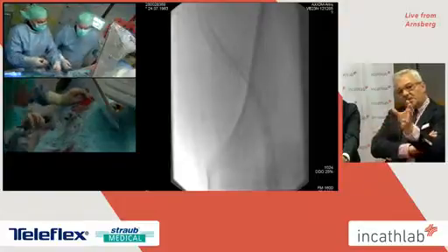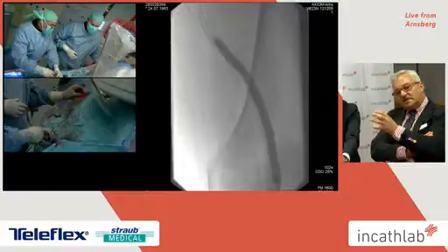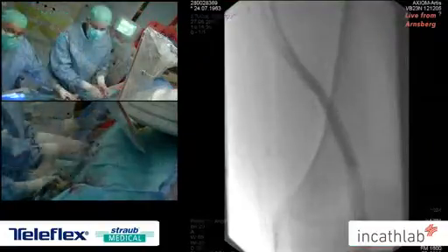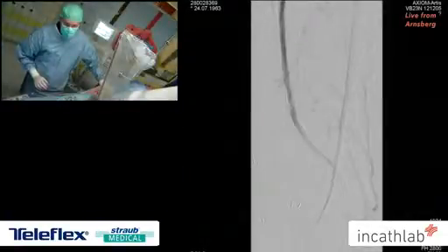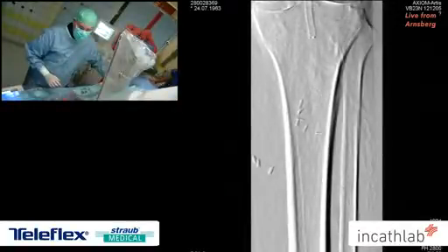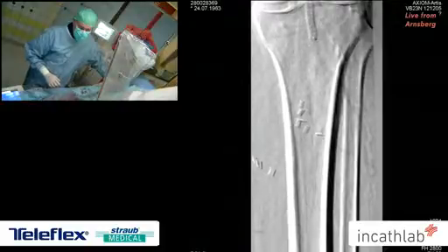The impression was that probably there was a surgical maneuver in that area, because the impression of cicatricial tissue in that area was really, really strong. So these are the final steps of this endovascular procedure.